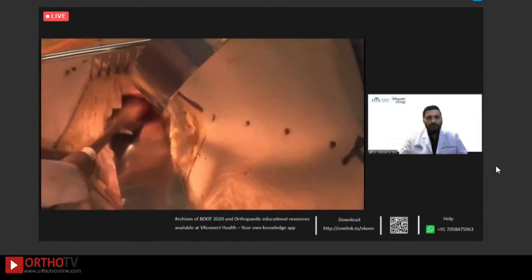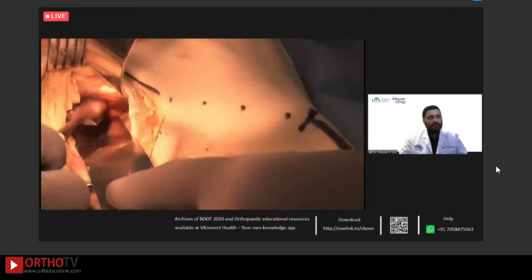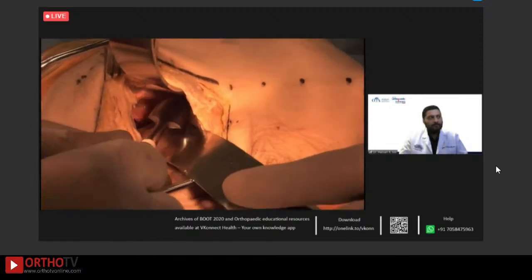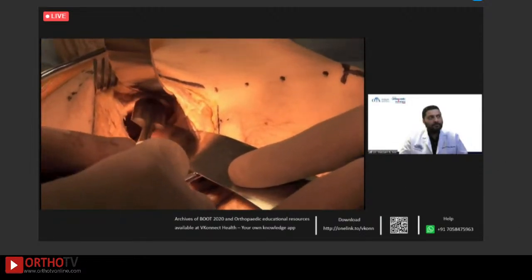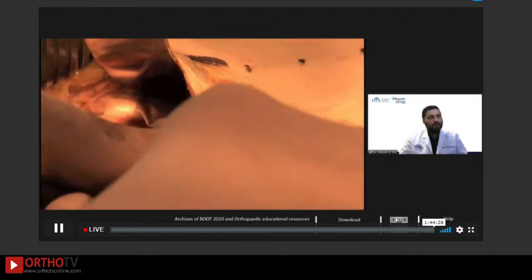Subperiosteal dissection is then performed along the superior ramus. Once past the pubic tubercle, a sharp Hohmann retractor can be placed over the ramus, which will greatly aid in intrapelvic visualization. The line on the model upcoming shows the area for the next part of the dissection.